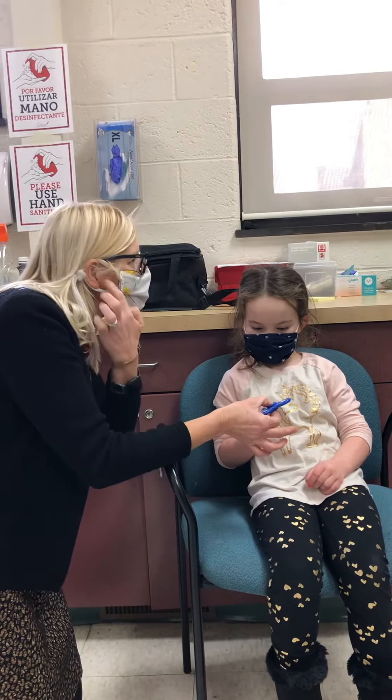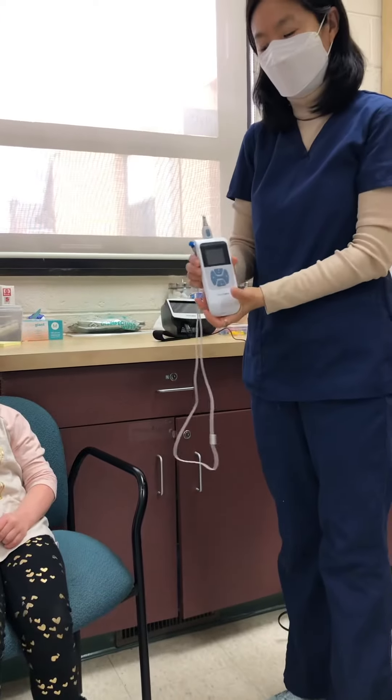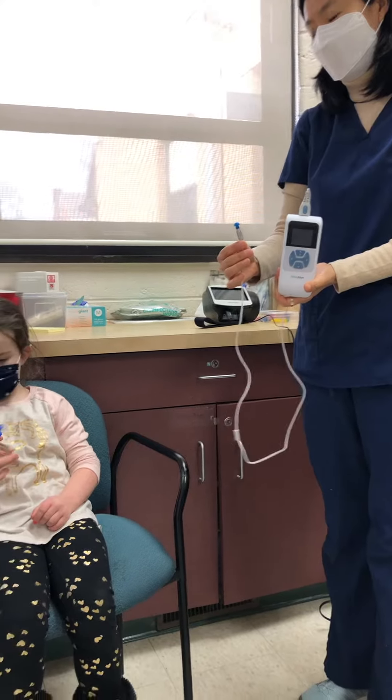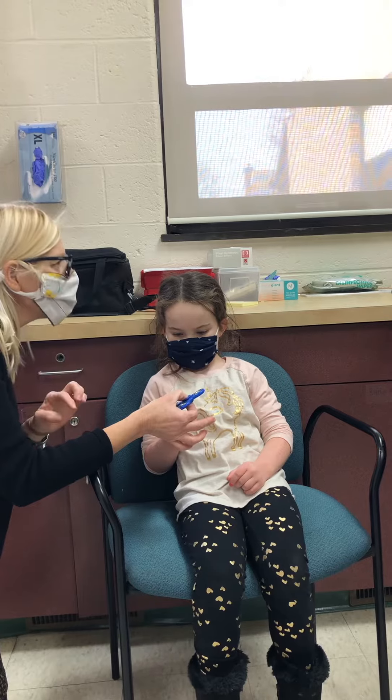Nurse Connie is going to check each of your ears. She has a special computer that she'll use and a little earbud that will go in each ear. It will make a little sound — click, click, click, click — and it will help your brain to know if you're hearing just like you're supposed to.